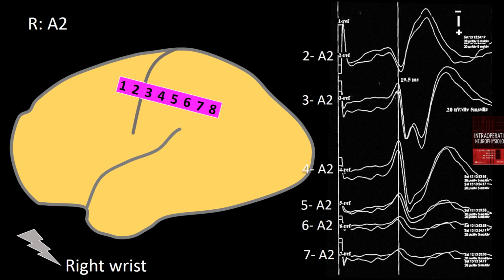In this new frame, I have introduced a montage with each electrode in the strip being referred to the right ear. An apparent phase reversal is present if we disregard the small difference in peak latencies of the two waves between the tracing obtained by the second and the third derivation.